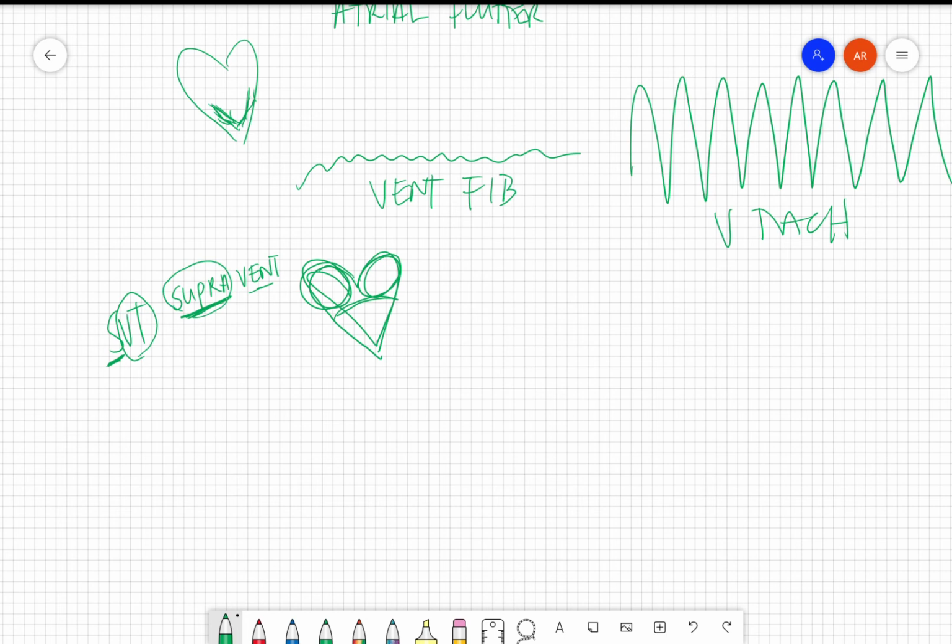It's really hard to see when it's going so fast, but what you see is a QRS, and then you'll see your T wave with a P wave on it, and it's just really tall, and it's tall, and it's tall. I can't draw it fast enough. But if you practice these and look at these often enough, you'll be able to see each beat comes on cue. It's really rhythmic. Mine's not that rhythmic, but each beat comes on cue like it's supposed to. So it's hard to tell what it is.